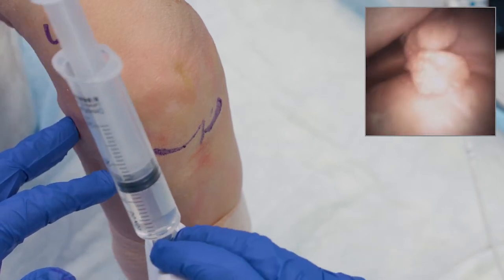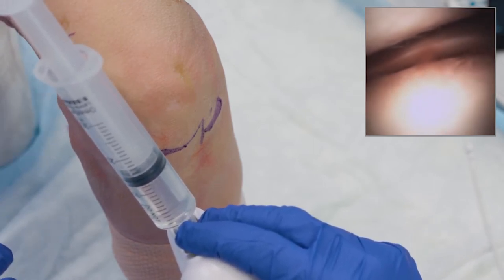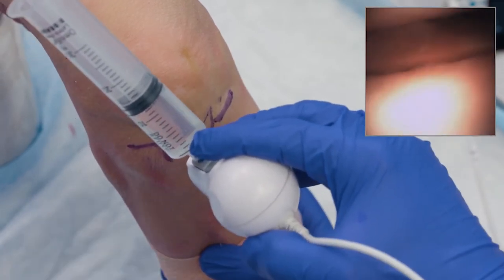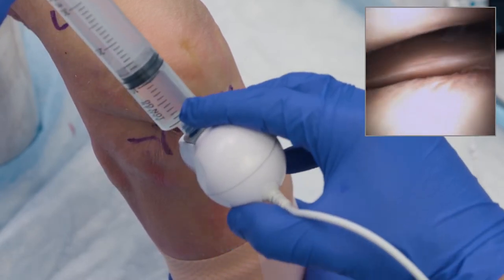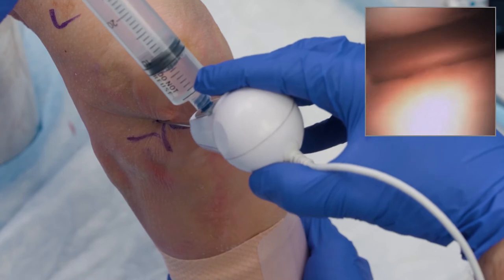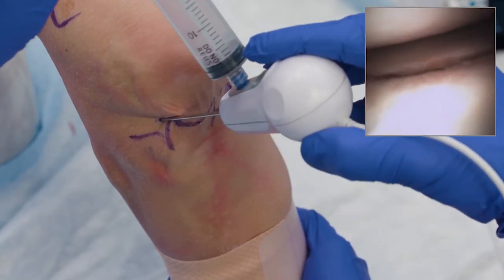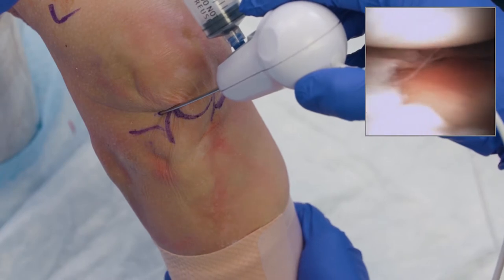Continuing on from the lateral portal, I'll gently move my hand toward the midline and I've entered the lateral compartment without much maneuvering. Just like in surgical arthroscopy, putting the leg into a bit of a varus thrust will help gap the knee open a little bit, and an assistant can hold that position. I'll give a little flush to clear my view, and I'm looking at the posterior horn of that meniscus from the root coming around toward the mid-body. I can see there's a loose body floating in my field. I can look at the femoral condyle cartilage and tibial plateau cartilage, and observe the arthritic changes on the tibial plateau and the lateral meniscus.